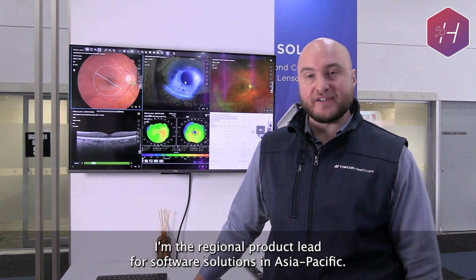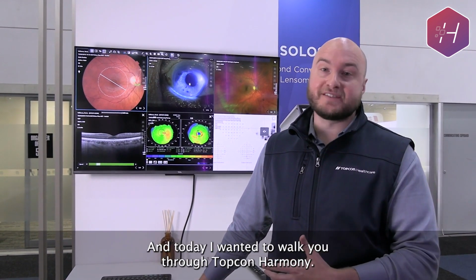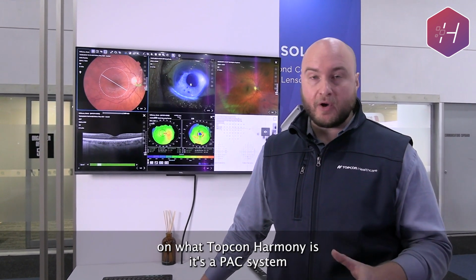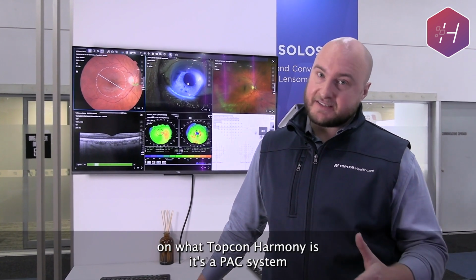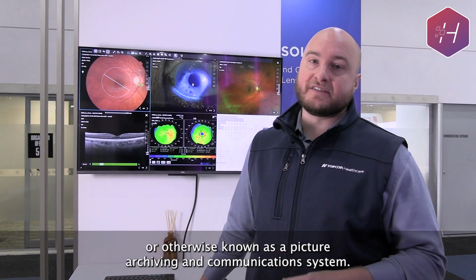Hi there, I'm Lachie Wheeler. I'm the Regional Product Lead for Software Solutions in Asia Pacific, and today I wanted to walk you through Topcon's Harmony. First of all, just to provide some context on what Topcon Harmony is, it's a PACS system, otherwise known as a picture archiving and communication system.